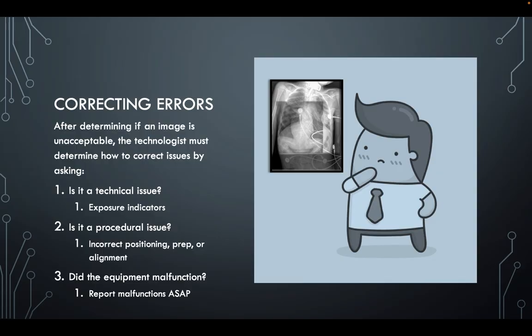There's not a ton of quantum mottle, if any, or the contrast and brightness is right where it needs to be. You'll see your exposure indicators get really messed up, especially if exposure field recognition is messed up, or the auto cropping that it likes to do for you is messed up.